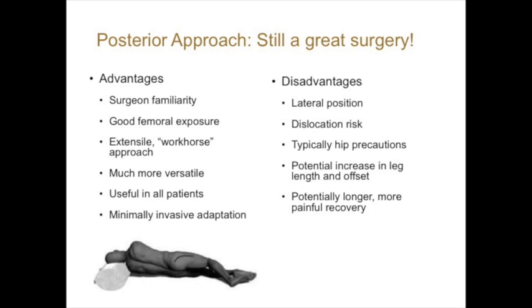Disadvantages are that a lateral position disrupts the normal position of the pelvis a little bit, and the normal position of a patient's pelvis when they're ambulating.